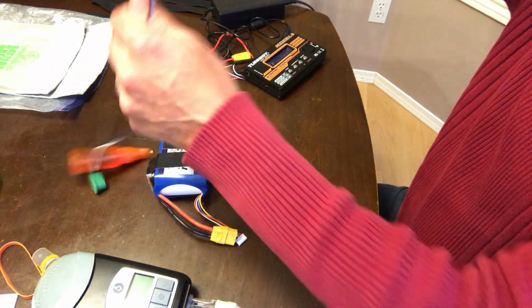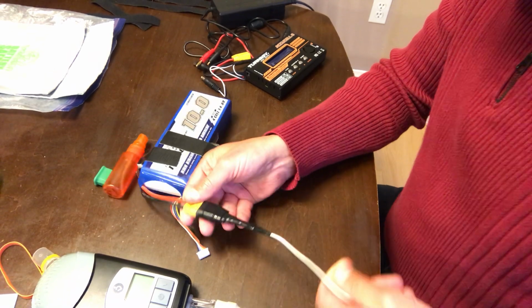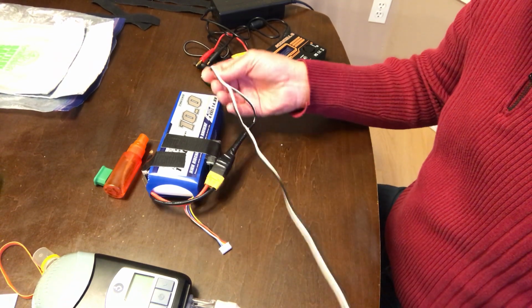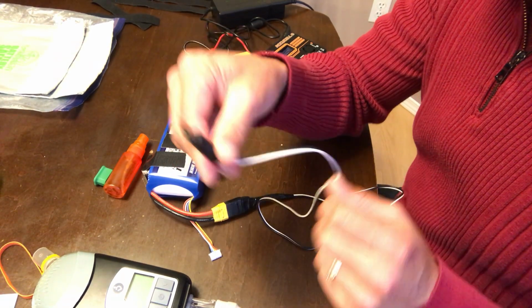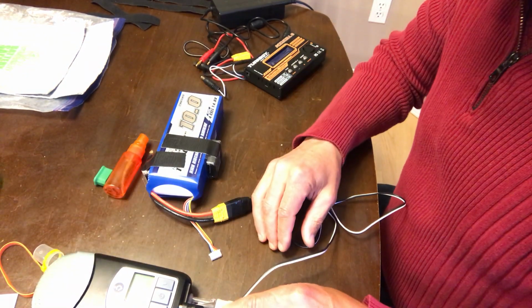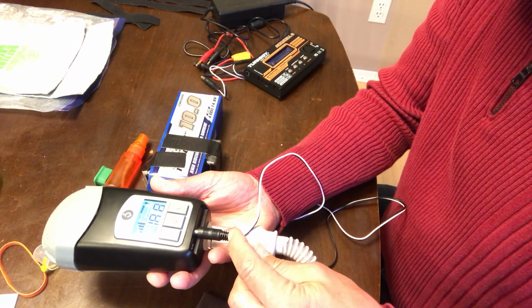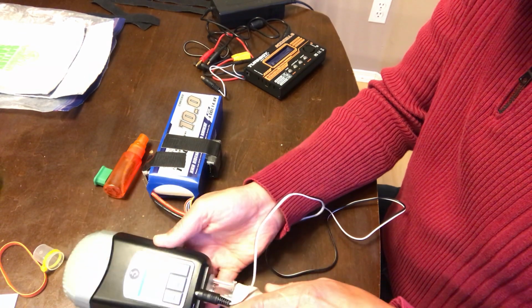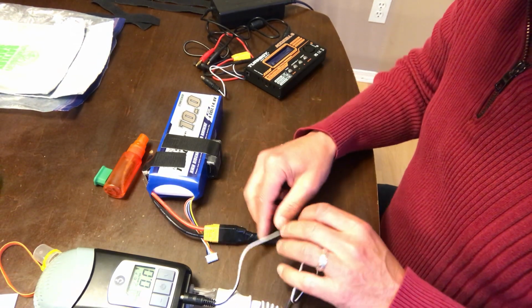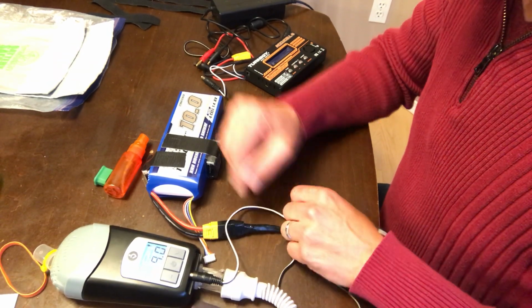Now you have another device. I bought a female XT90, and then you can see my fancy job here. I made it really stout because I just couldn't afford to have anything break while you're out there. I used that same barrel plug I figured out before, which I think was the 5.5, and that plugs into there. And interestingly enough, the end of this hose kind of presses against the end of this plug, conveniently. And this set of wires I bought on Amazon. And then of course you can see it lights up, and you can start it, and it does the same thing.